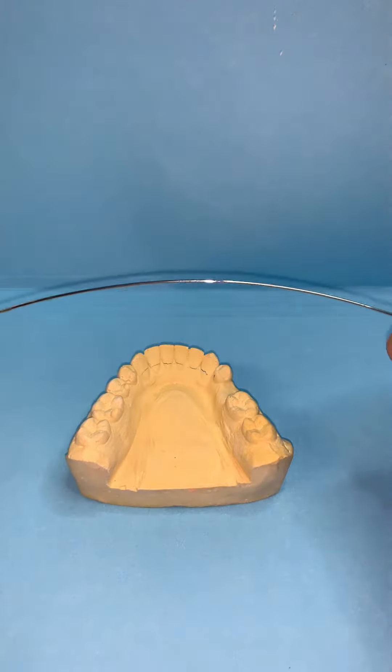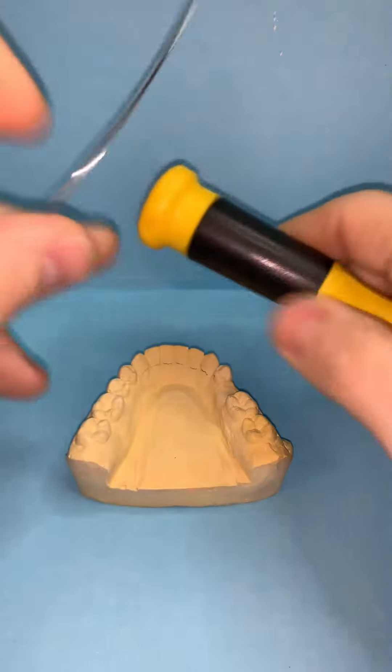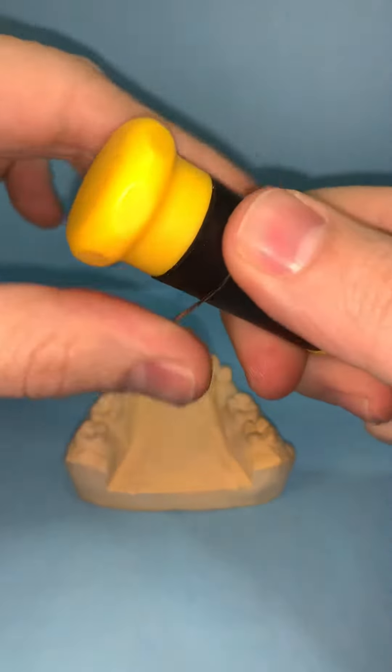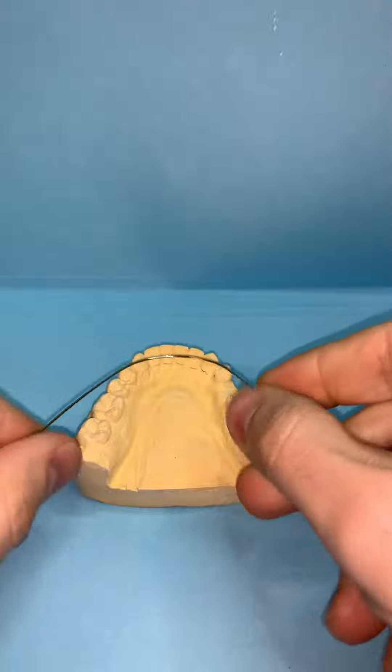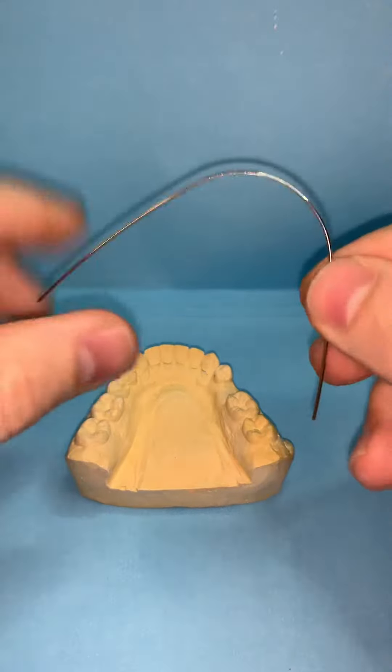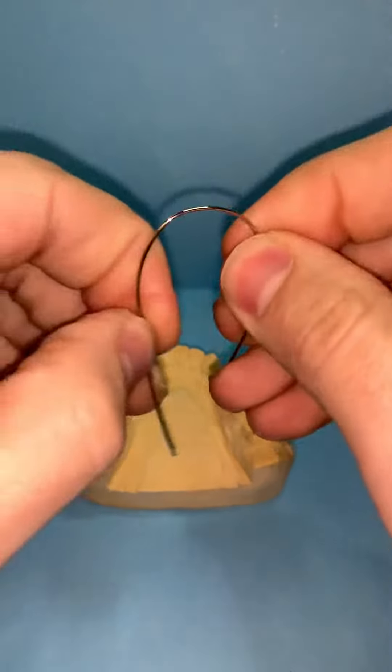So how do we bend it? Start with a wire, get it into an arch smaller than the patient's mouth. As you see, it's still a little larger, so we want to make it a little smaller.